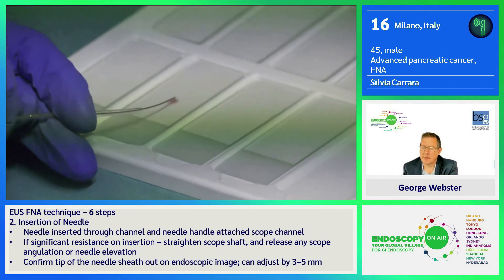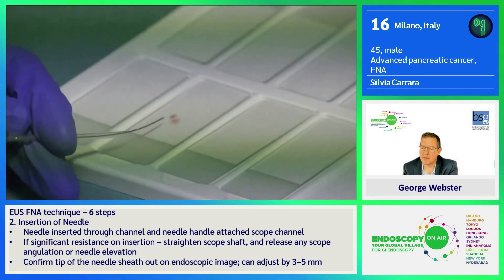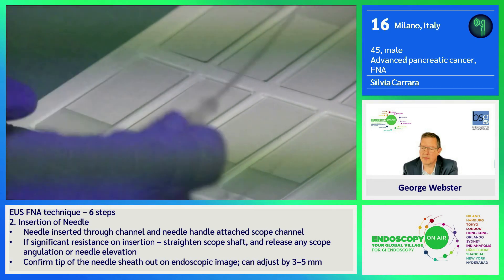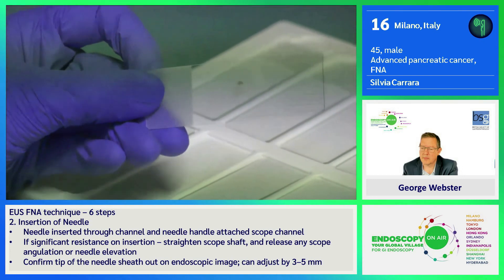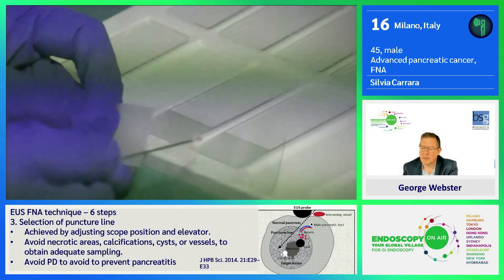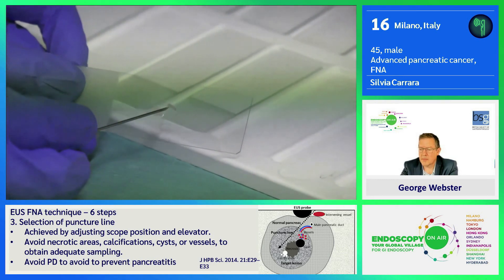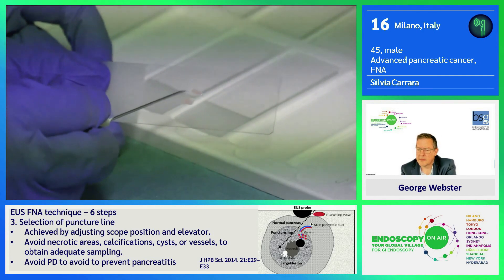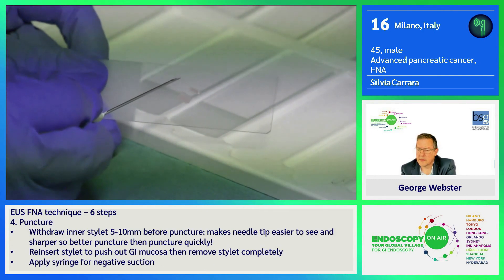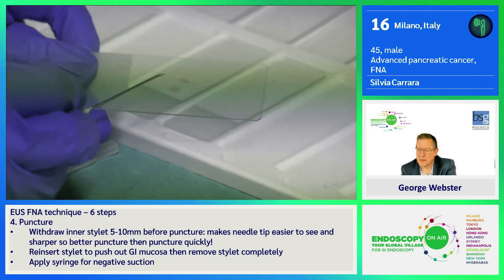Pull down the stylet. As I mentioned, the tumor is a little bit necrotic and also mucoid, so you have this material. There is a small core here if you can appreciate it. When using MOSE, we usually perform three passes as the guidelines recommend, and we send the samples for final pathological examination.